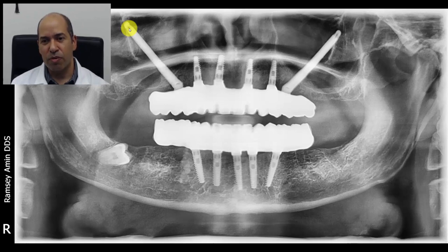These are called zygomatic implants — extra long dental implants that engage the cheekbone. They're meant for more extreme cases or patients that need teeth immediately on the upper jaw. I'm showing this more so you get an idea of what's normal and what's not. These would be considered kind of average length — regular dental implants, probably about 13 millimeters. These are longer, about 16 millimeters. Anywhere from about 10 to 12 millimeters and above is a good range. If you can't get long or wider implants in, then you put more of them — that gives more support that way.